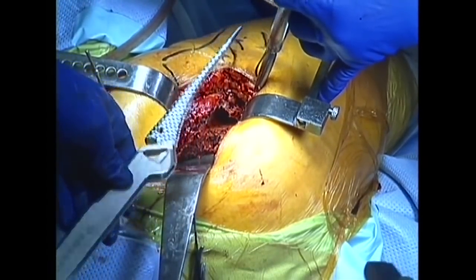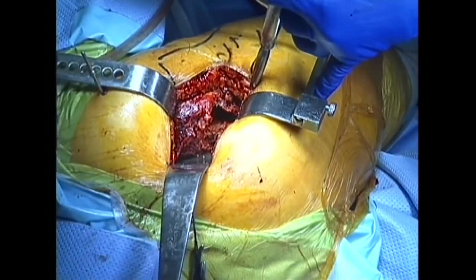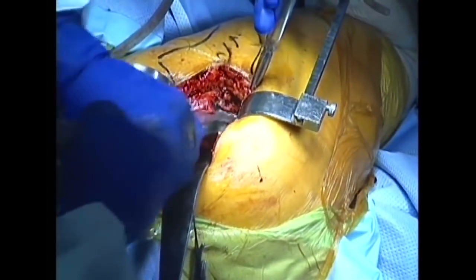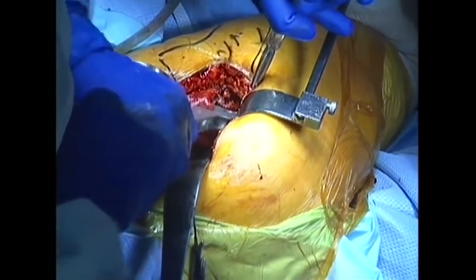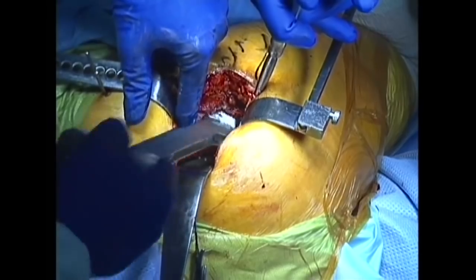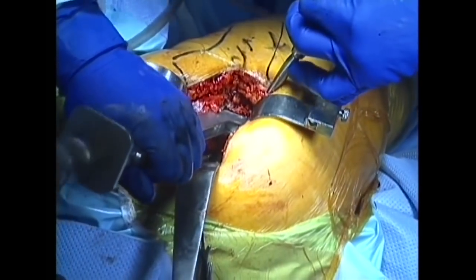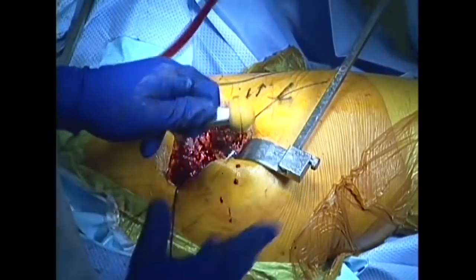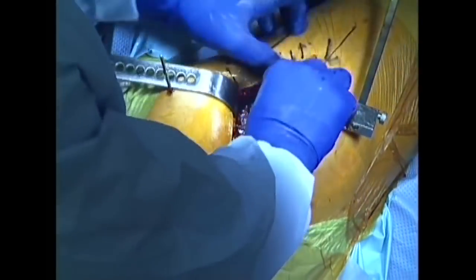Preparation of the canal is complete. An appropriately sized femoral stem is selected by inserting trial implants into the canal in progressively larger sizes until a tight fit is achieved. The trial implant is fitted with a trial head and neck, which are available in varying sizes, allowing the surgeon to customize the fit for each patient.